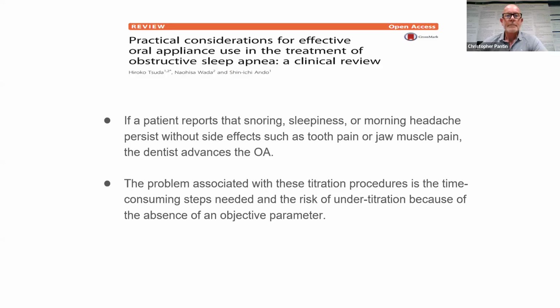Okay, so these are the practical considerations for effective oral appliance use for sleep apnea. If a patient reports that snoring, sleepiness, or morning headaches persist without side effects such as tooth pain or jaw muscle pain, a dentist advances the oral appliance.